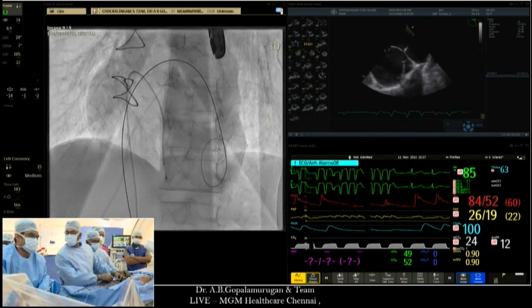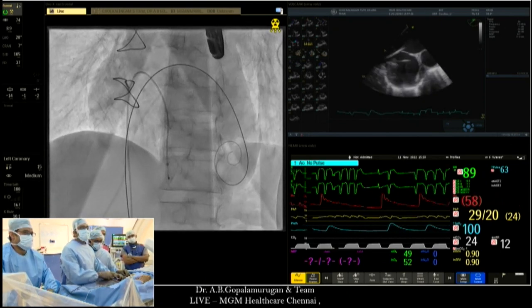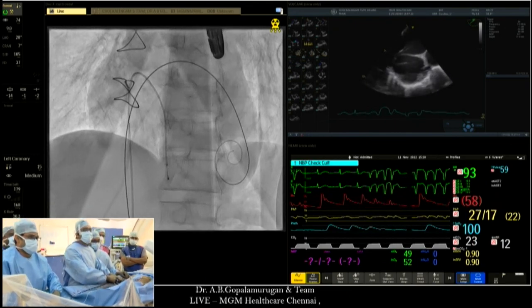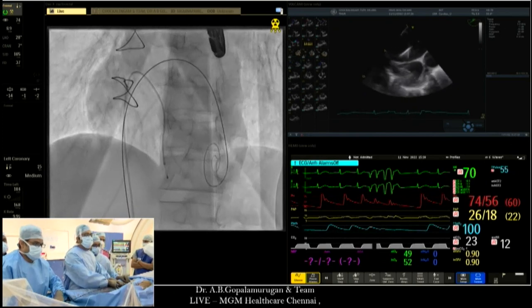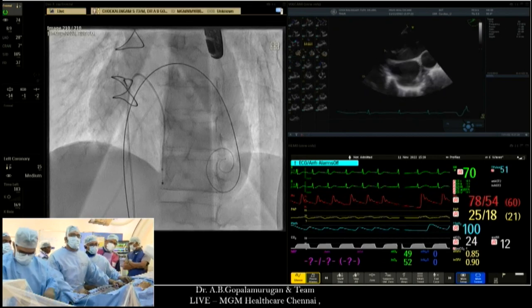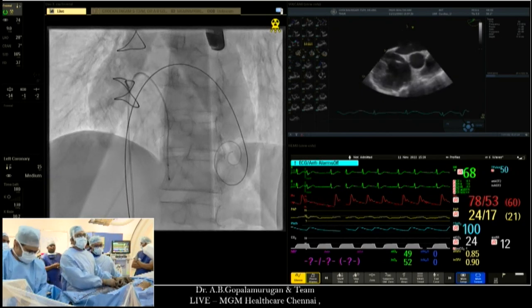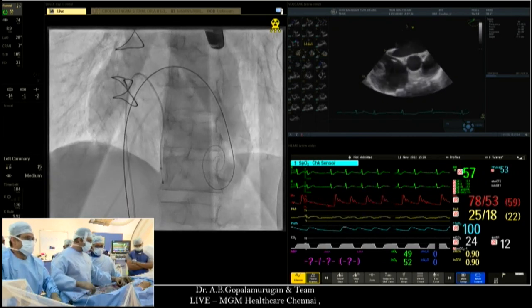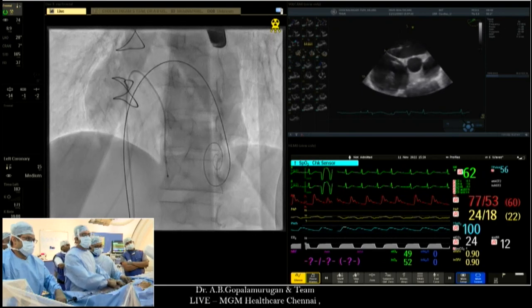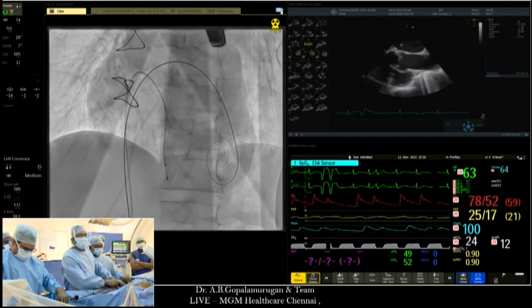So okay, Gopal, are you using Binoy Bapat's app for ID? Yeah, I do. Which app are you using? No, I don't use the app routinely. I would check the valve personally. So nowadays, this was the time when we had to go in blind. The valve app also tells us roughly what the size is if you knew the valve by a surgical valve. But sometimes we don't always get the surgical note, and to have the best confirmation, I like to use the actual CT, and that tells me the diameter. Now, we always get a CT in all.